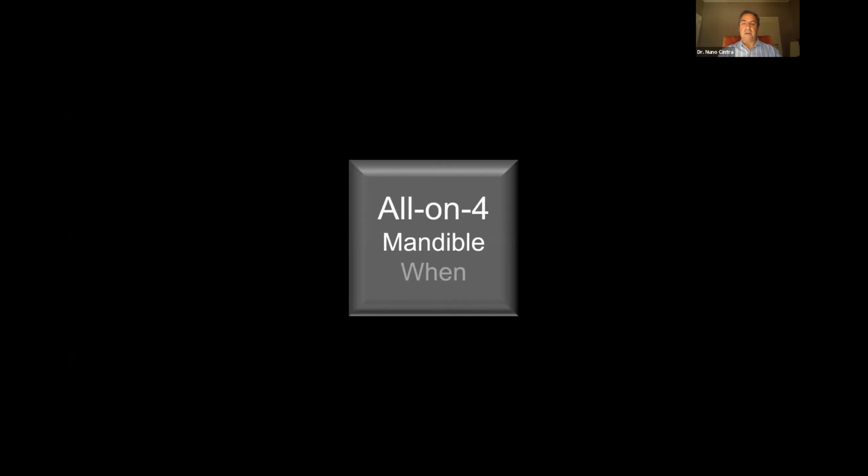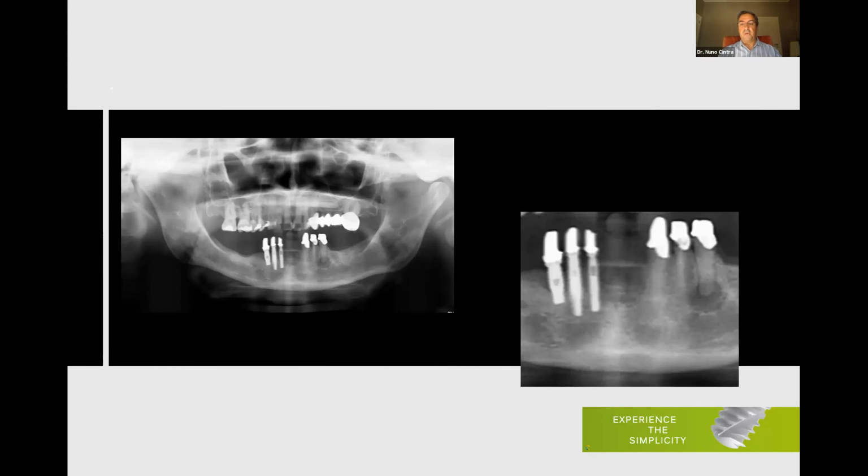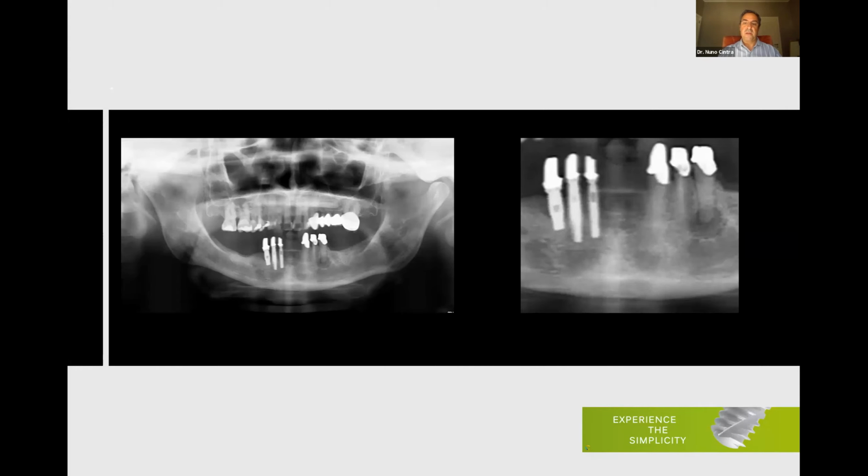What about the mandible? Well, the mandible is more or less the same thing, except that when we have full bone volume, again, we go for 6 implants, of course. Like in this case, it was a lady with this treatment made 15 years ago in South Africa. And she came to us because this was removable. This was a removable rehabilitation.